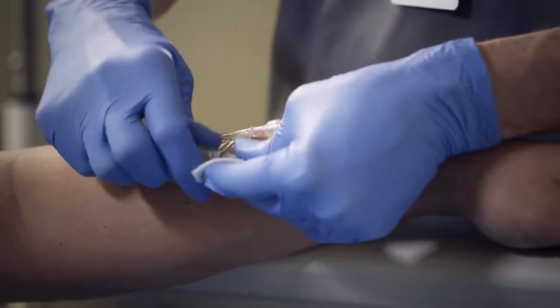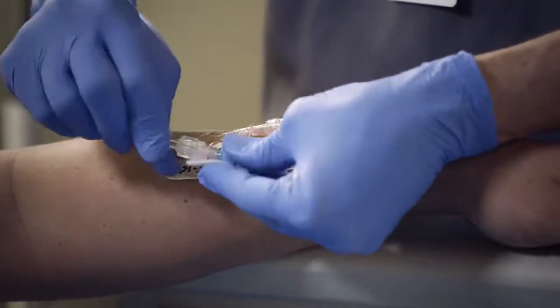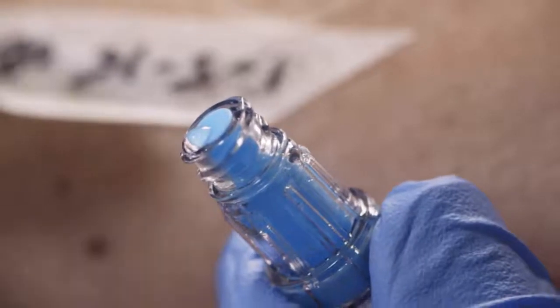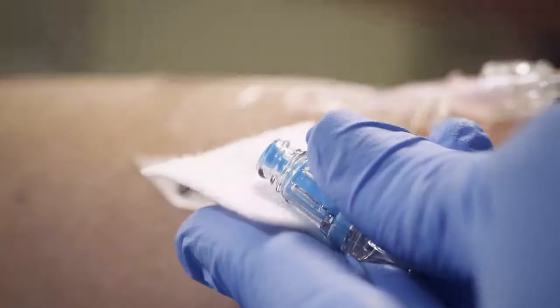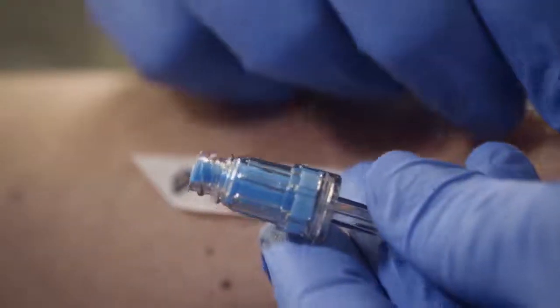To detach, disconnect the syringe or tubing slowly and with control. Hold the connector, not the catheter, when disconnecting. Because the access surface is solid and completely sealed, a small bead of fluid will likely remain after the luer is removed. If necessary, simply be prepared to wipe away any remaining fluid.